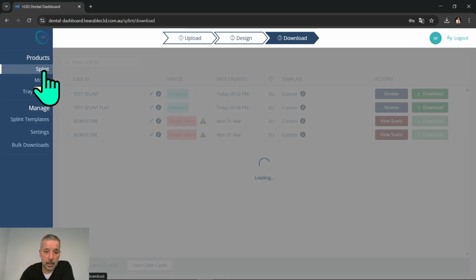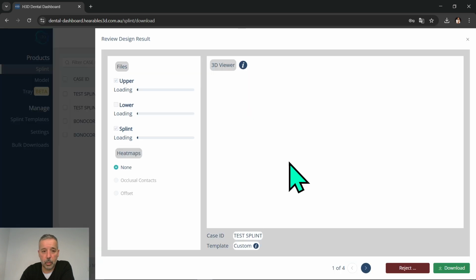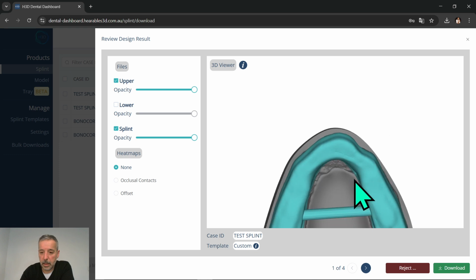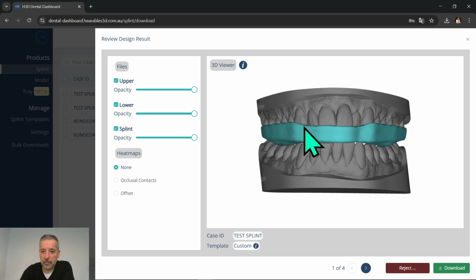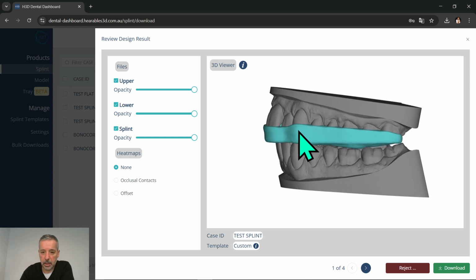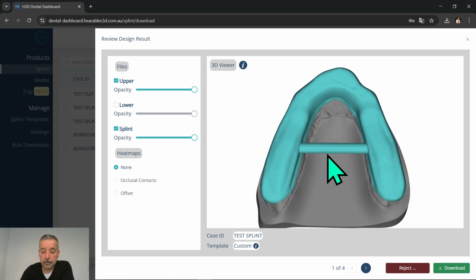We can take, okay, new design. We can check. Look, now the design is just 2 or 3. Download and you review. Okay. This is another one. Look, a little bit different. Minimum thickness in the front, and smooth change in the canine. Also contact point, but interesting. The bar for printing or maybe for milling.